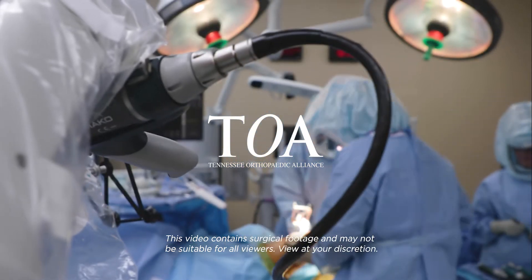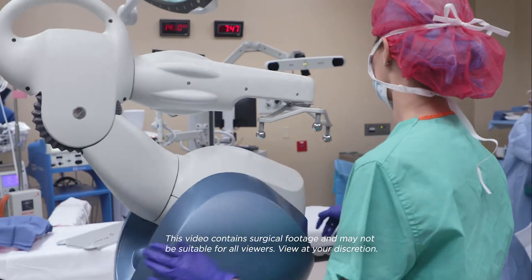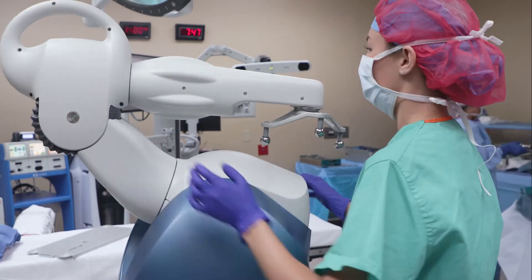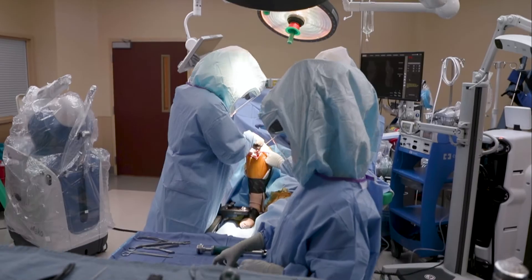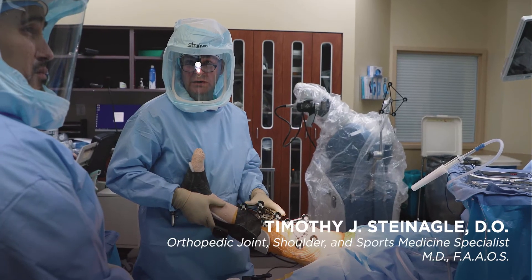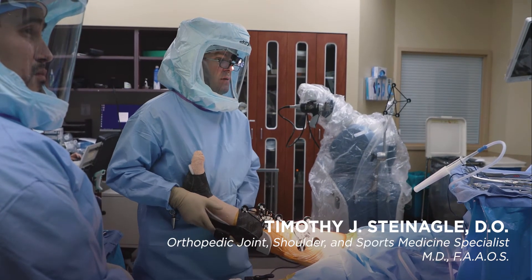Mako is a robotic-assisted device that helps with knee and hip replacement. Everybody's joint is a little different, and as people get arthritic they often have deformities in their joints. You can make corrective cuts and preparations that allow you to restore a joint to its normal position.